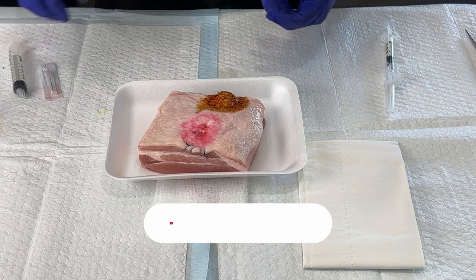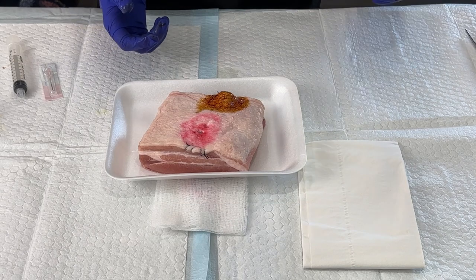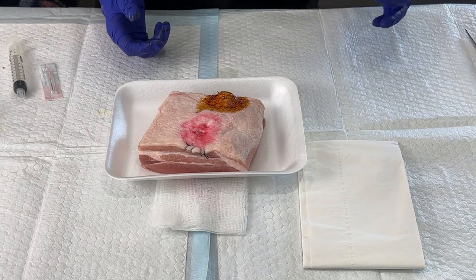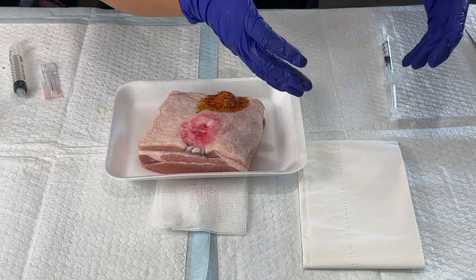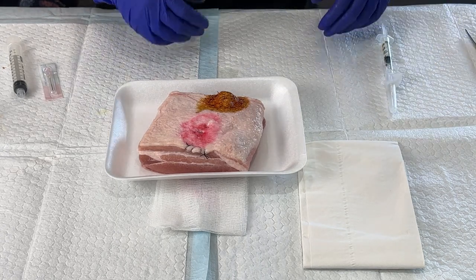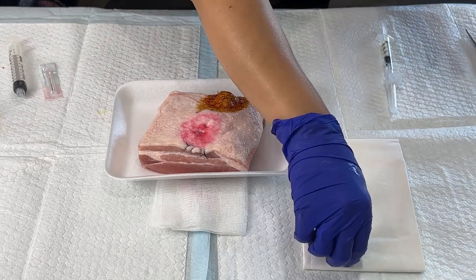Since you're just going to be doing one poke and aspiration, you don't necessarily have to put anesthesia, but I tend to offer it to all of my patients. Once we're done with that, we would get our sterile suture kit, open it up, put on our sterile gloves.